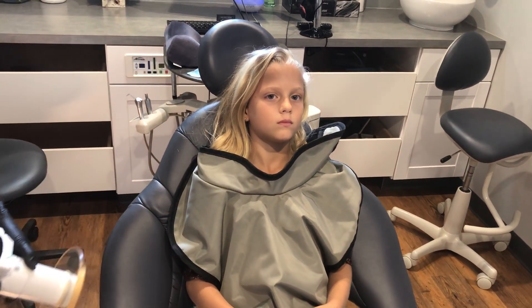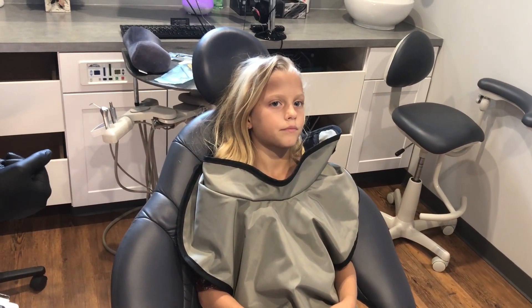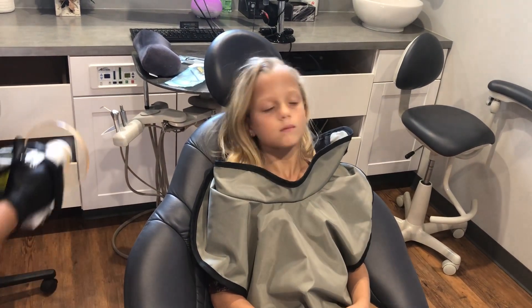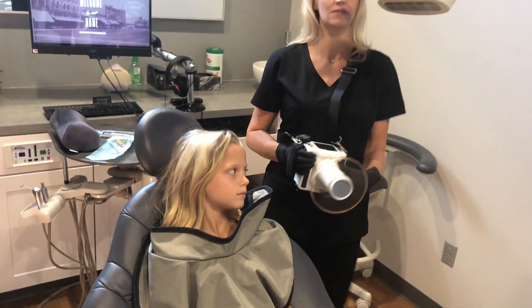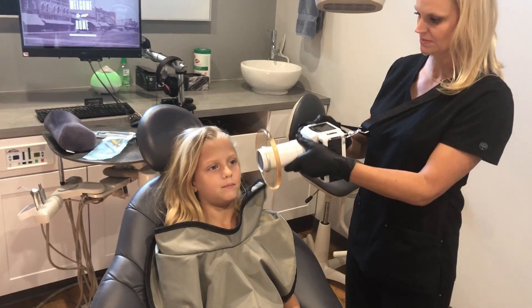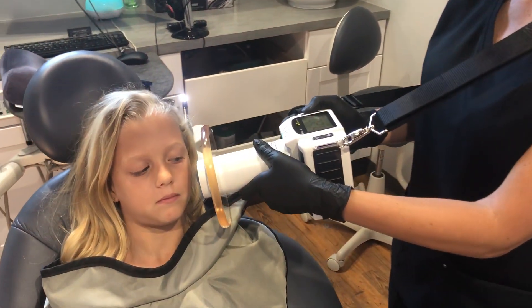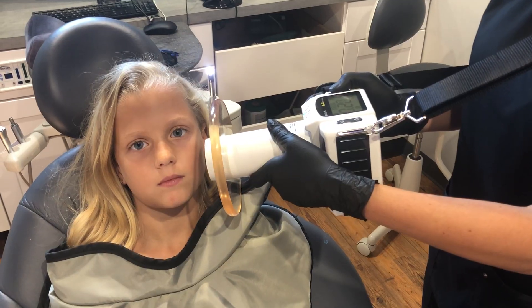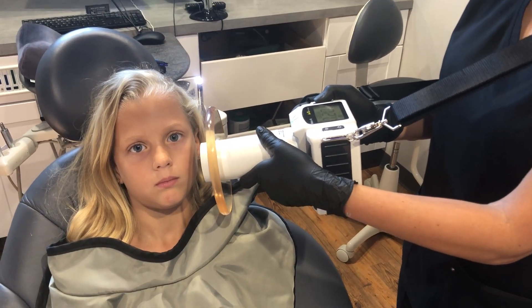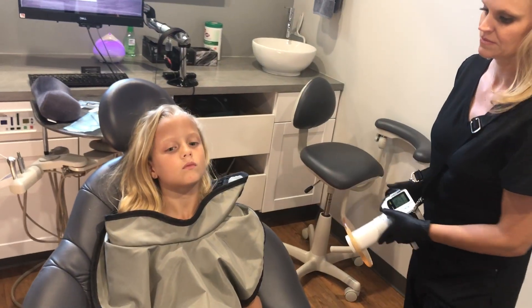For the next position, the next bite wing you would take would be the same thing on the other side. Move a little bit closer to the cheek all the way over. The main thing is keeping the unit straight, or perpendicular to the patient.